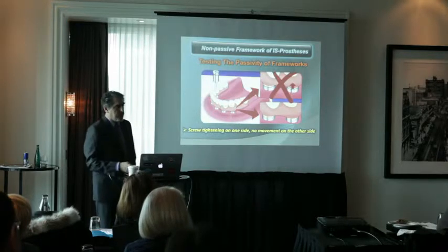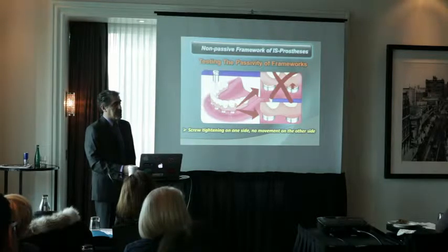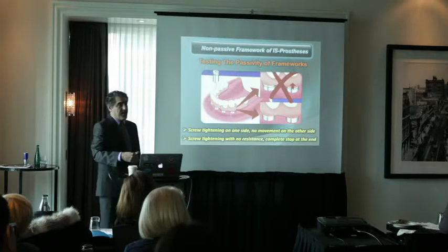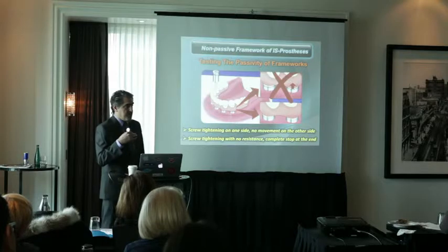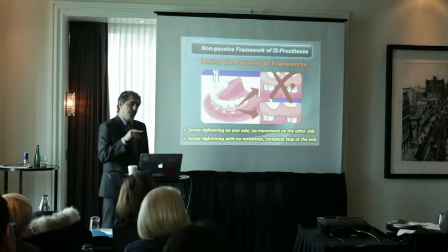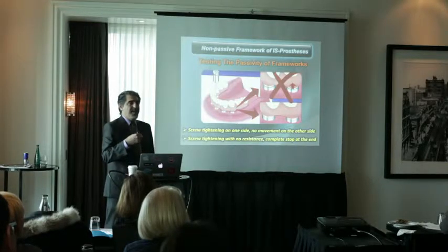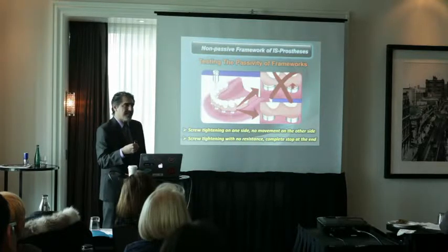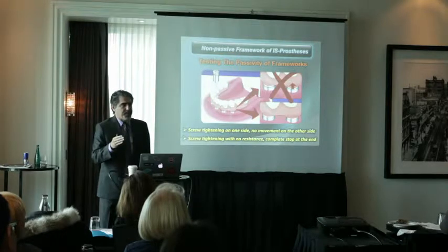And that will tell you if the framework is passive or not. The next level of knowing if your framework is passive or not is when you are tightening the screw, it comes to a complete stop. It's not like getting tighter and tighter and tighter. It goes all the way and then boom, it stops.